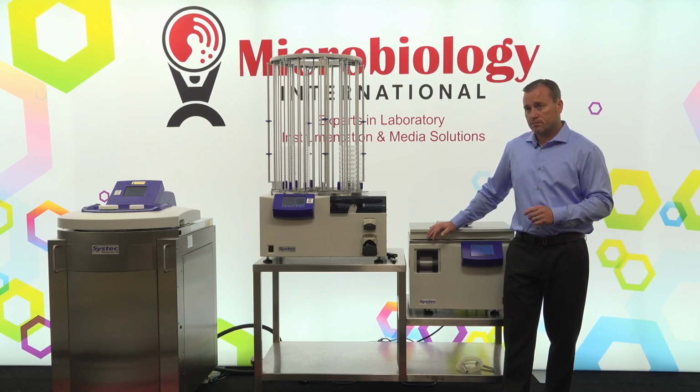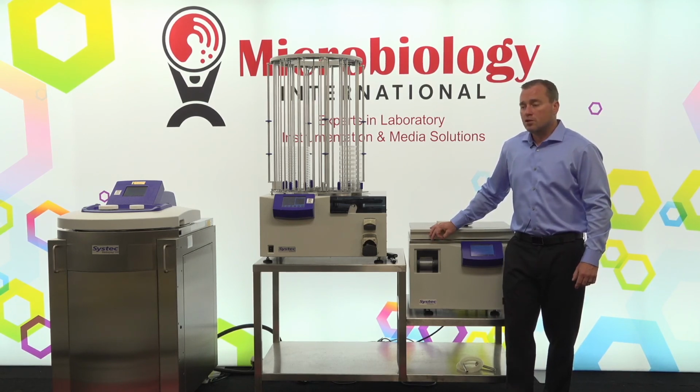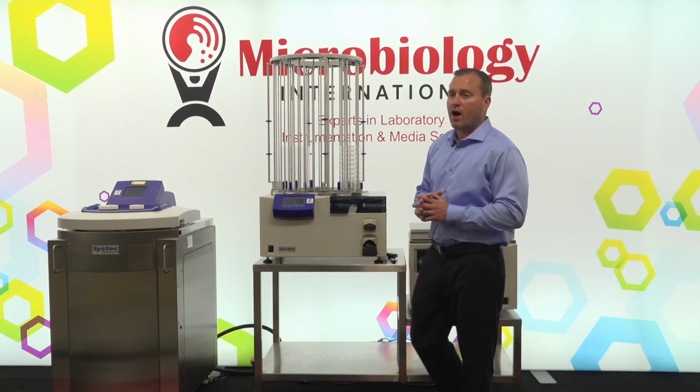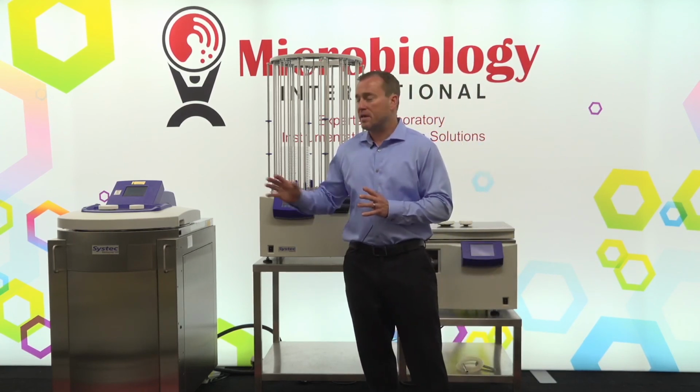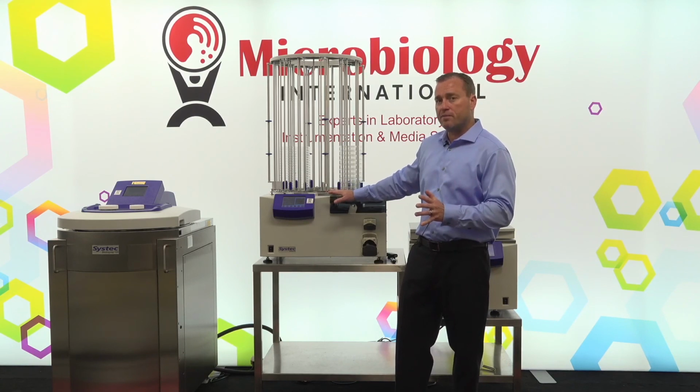And then we just got another question regarding access levels. What's the difference between the user and the admin? And so we have up to 5 different user levels programmed into the MediaPrep systems, not for the MediaFill because it's not pressure and temperature related.